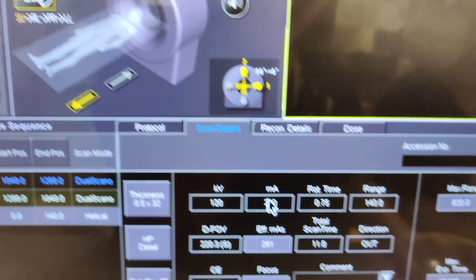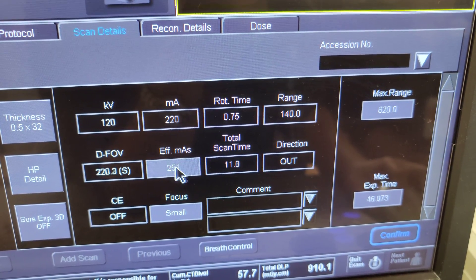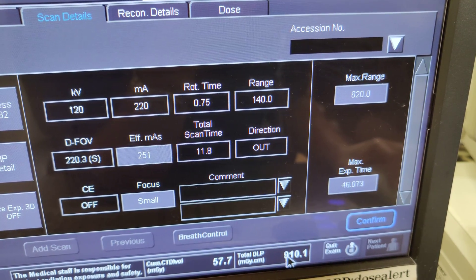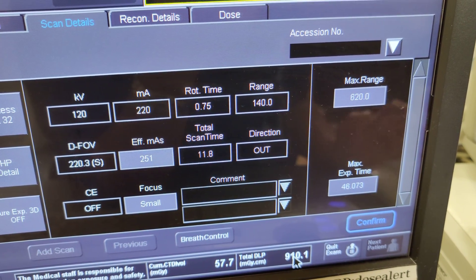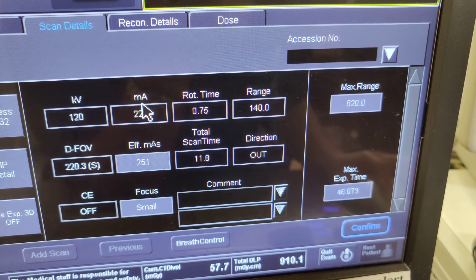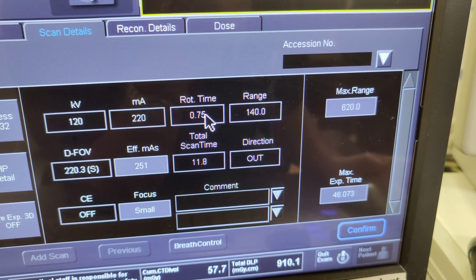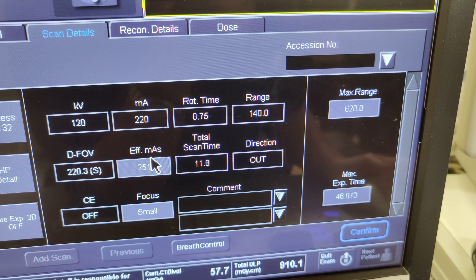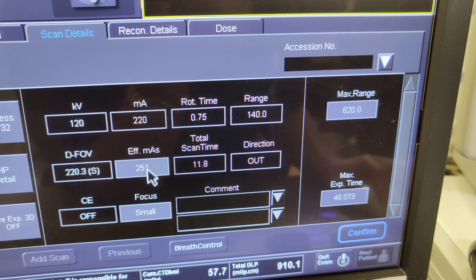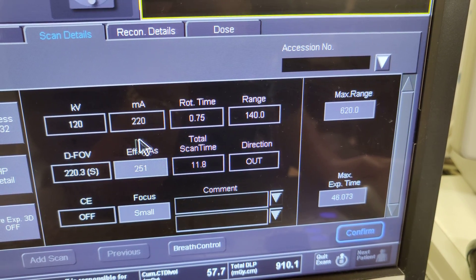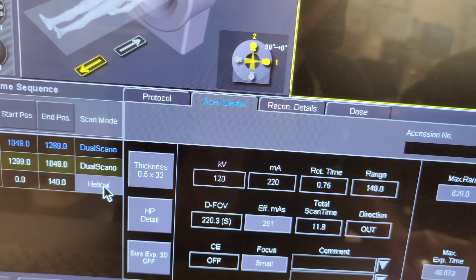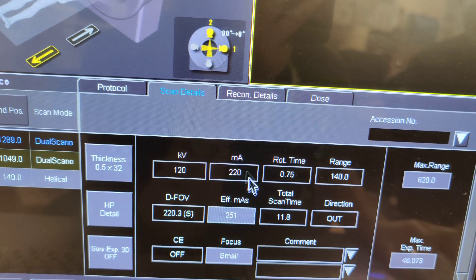When we do a head scan, this is the effective mAs we're targeting. We want to aim for 251 mAs and the DLP will be around 900, and of course this will change according to the anatomy. We know that MA multiplied by rotation time in seconds gives you mAs, and that's your mAs here. You can find that under the helical scan details and it'll show up.